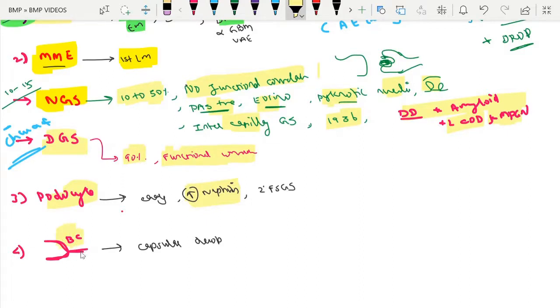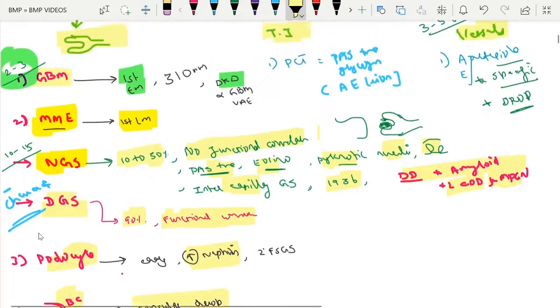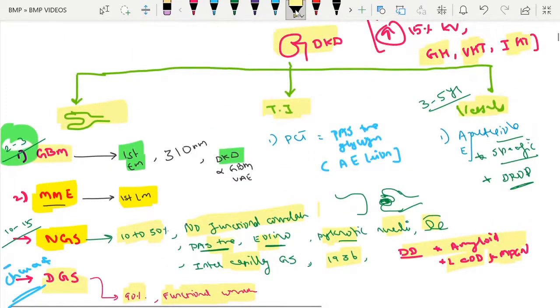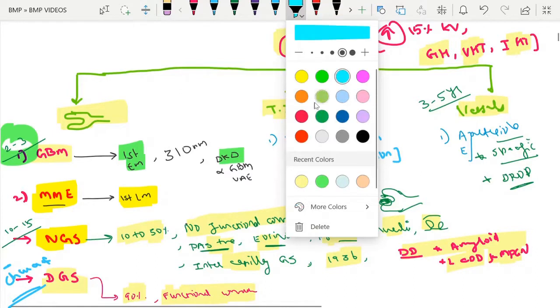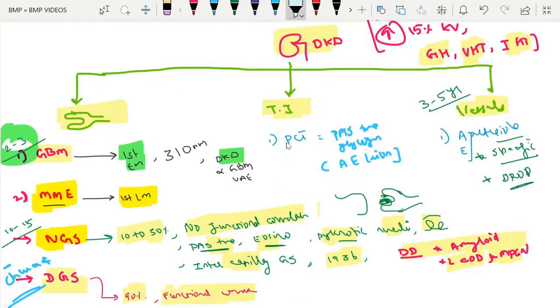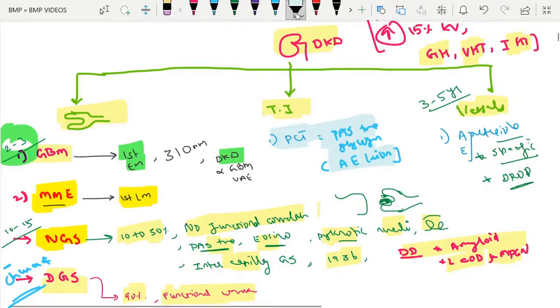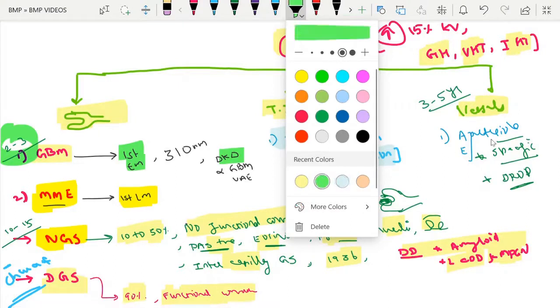Podocyte injury sometimes results in secondary FSGS. Regarding the Bowman's capsule, there is accumulation of hyaline material below the parietal epithelial cells, which is called the capsular drop. In the tubular interstitial part, within the proximal convoluted tubule, there may be accumulation of glycogen — a PAS-positive material — which is called the Armanni-Ebstein lesion.